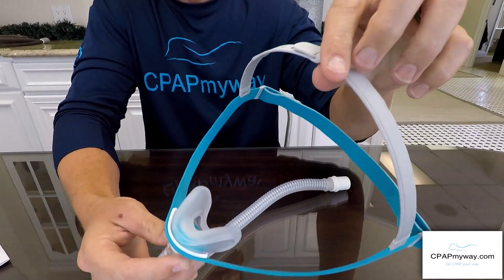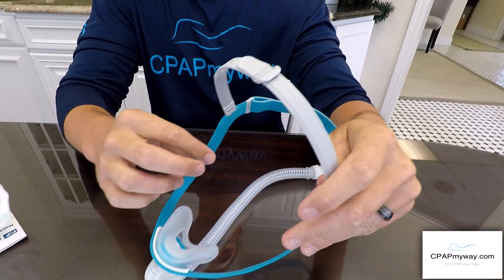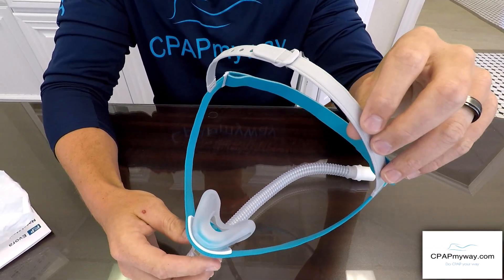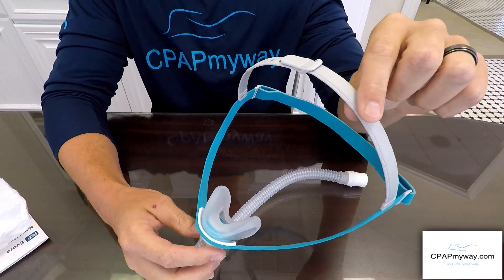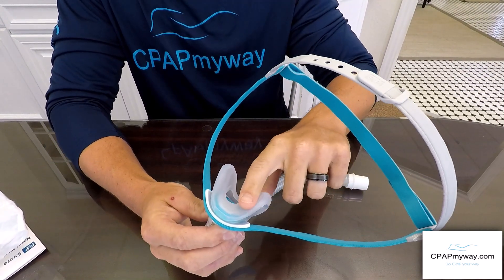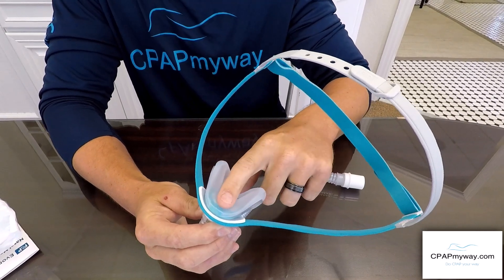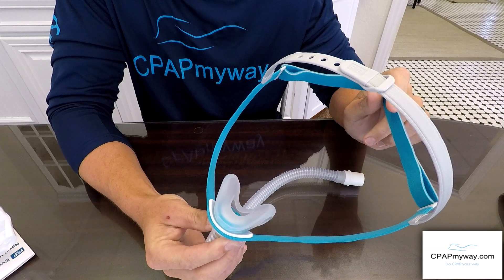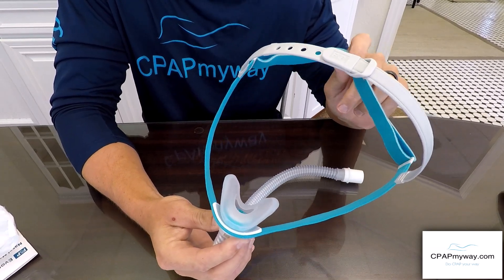Additionally, the headgear is a rigid headgear — it's built to be kind of like a baseball cap in that once it's sized to you, you basically just slip it on and off really easily. The cradle's silicone is super soft, much like the Brevida previously, so it's a really comfortable mask and we think you're gonna like it a lot.